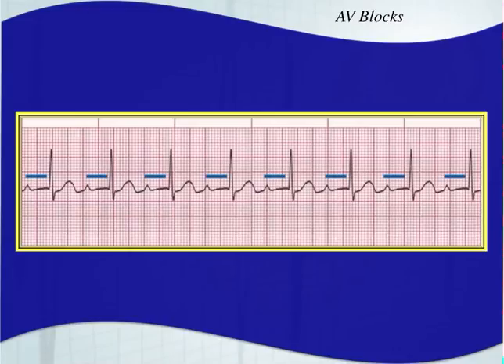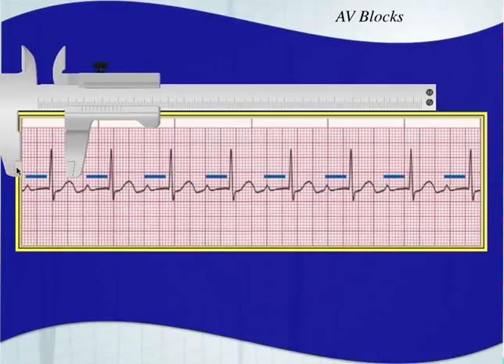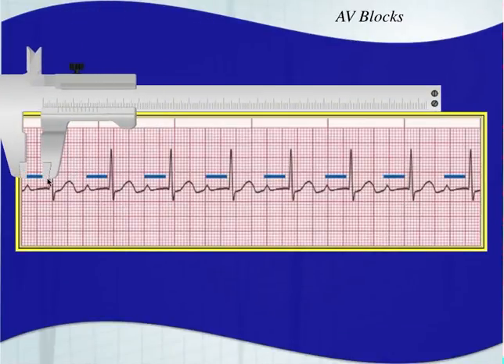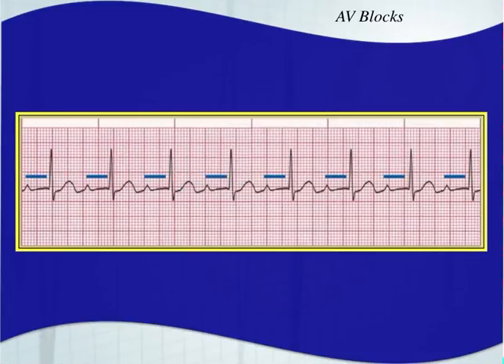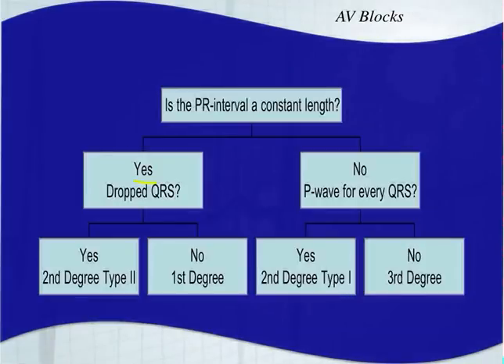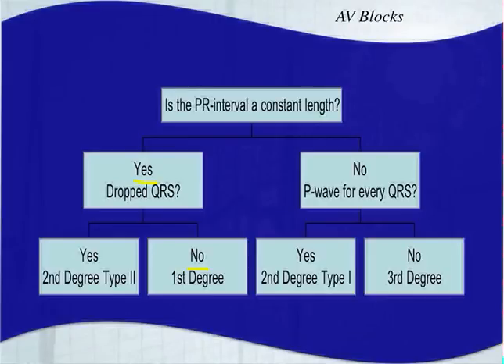Here's the first example — a first degree AV block. The PR interval is staying consistent throughout, and there are no P waves that lack a QRS complex. No dropped beats, so we have a first degree AV block.